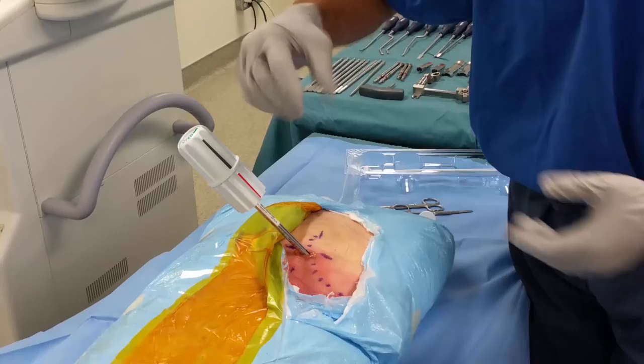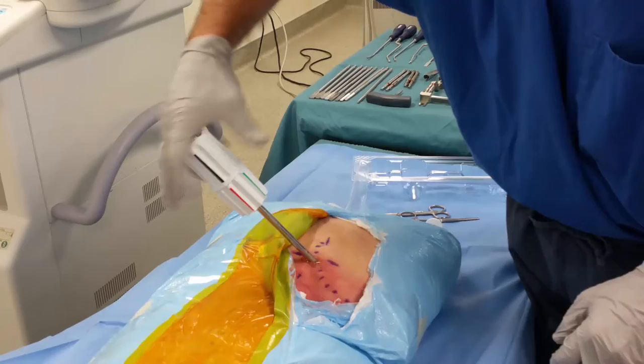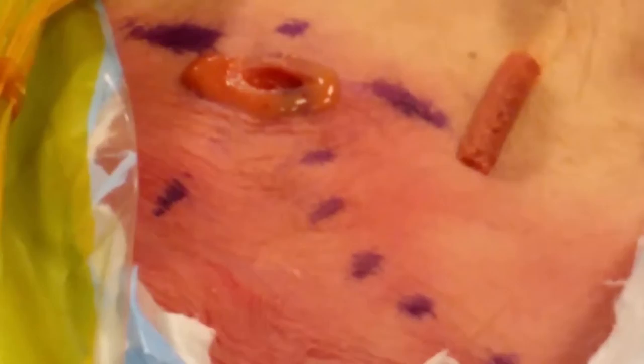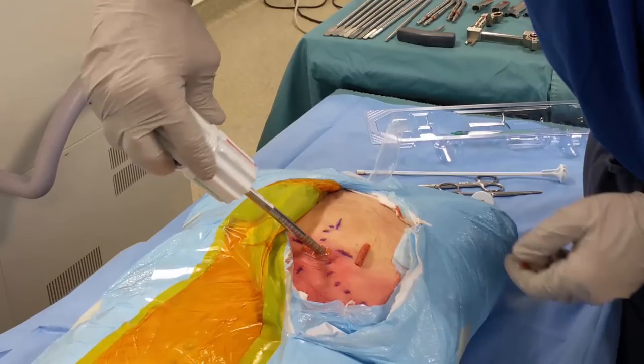Now I'm going to lock it, and it's kind of like wringing a towel. It's not fingertip — it's grasp and rotate. And then I'm going to rotate it out of the hole. You can see the lower window. We have the bone captured. Now we're going to take our tamp and we're going to deliver the bone. That's the first piece of bone.